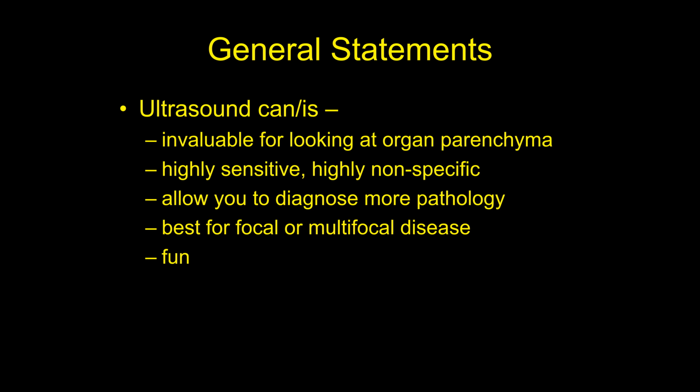Ultrasound is also best for focal or multifocal disease. Okay. The example of this inside the liver, if I have a big mass, neoplasm, cancer in the liver, and it's one big, large mass, typically that part of the liver is going to look totally different on ultrasound than the rest of the liver. Okay. So it's easy to see.